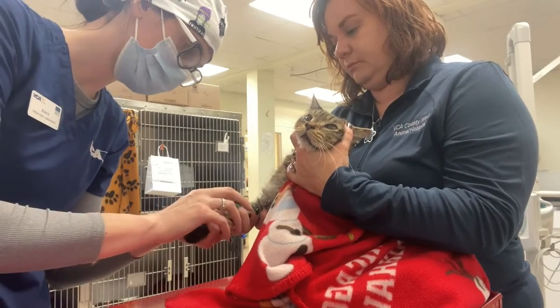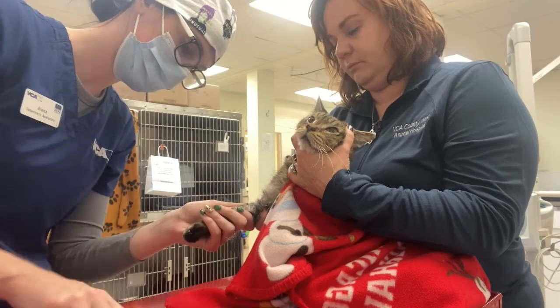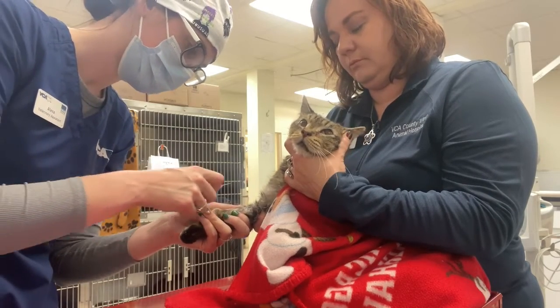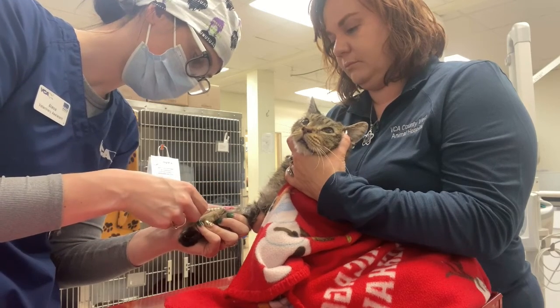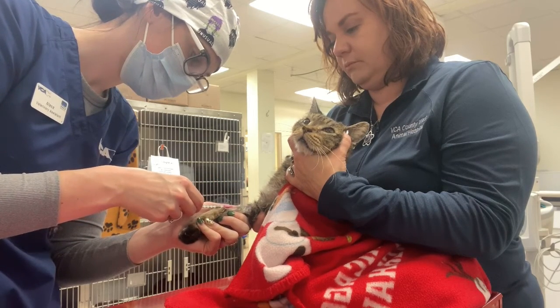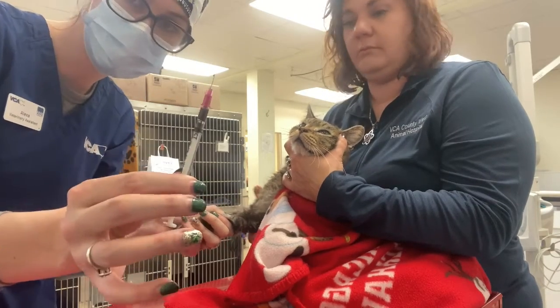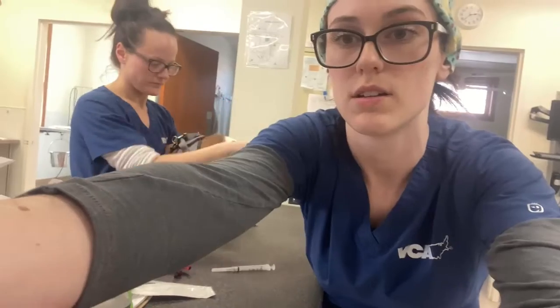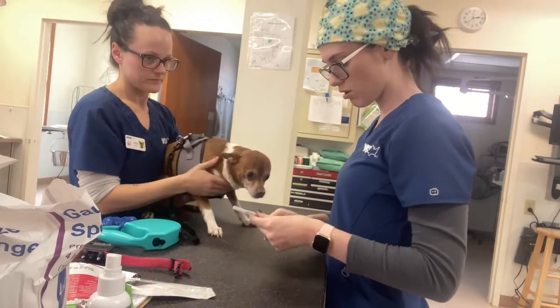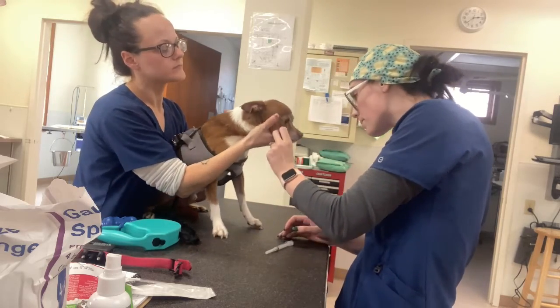Okay, cephalic blood draw. Good boy, Bubba. All right, he's diabetic, so we're gonna check his glucose real quick. Jugular blood draw. Bubba, let me see your nipple. Good boy, up.